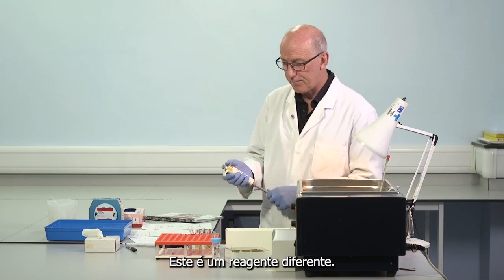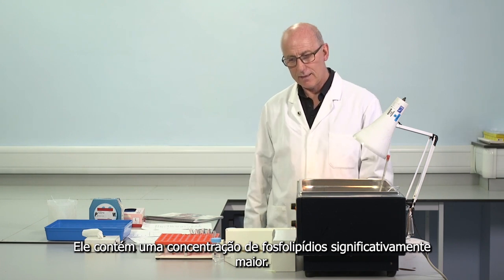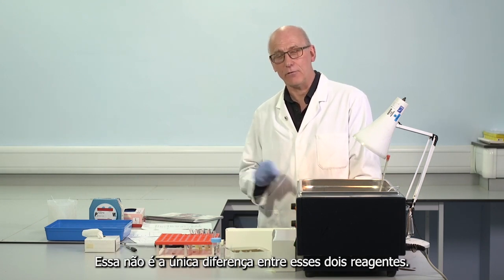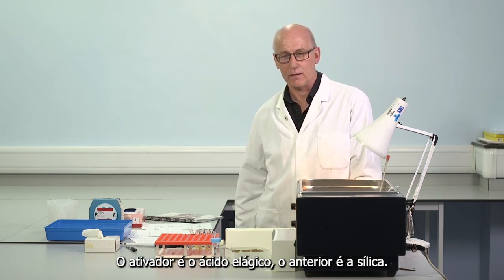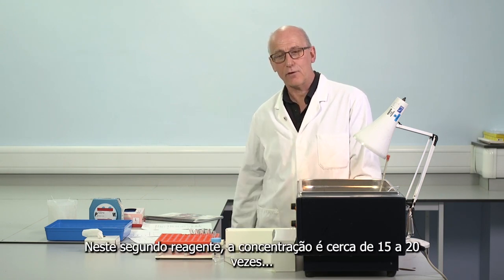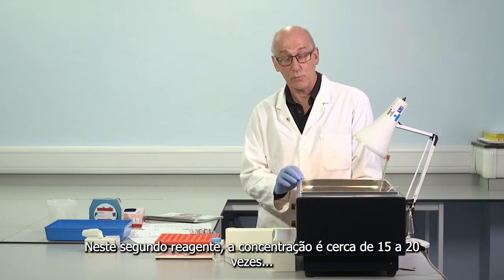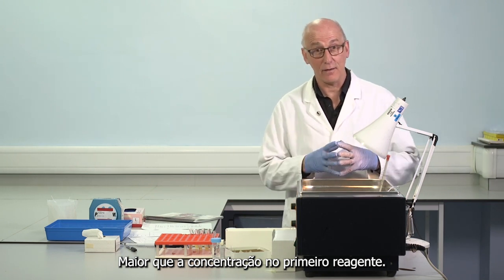This is a different reagent. It contains a significantly higher phospholipid concentration. It's not the only difference between these 2 reagents. The activator is ellagic acid, the previous one silica. The biggest difference is in the phospholipid concentration. This second reagent, the concentration is around 15 to 20 times higher than the concentration in the first reagent.